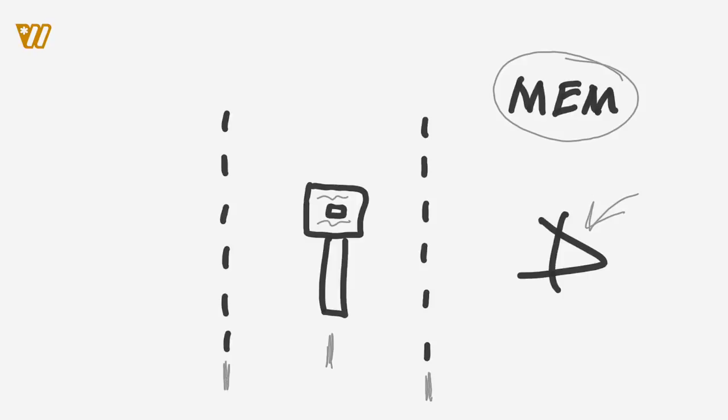If they're accommodating behind our retinoscope, right, is that going to be a lag or a lead? Yeah, that's going to be a lag of accommodation, right? So a lag of accommodation. What about if they are focusing in front of our retinoscope, right? That's going to be a lead in accommodation, right? So lag of accommodation, they're going to be focusing behind the retinoscope. Lead in accommodation, they're going to be focusing in front of the retinoscope.